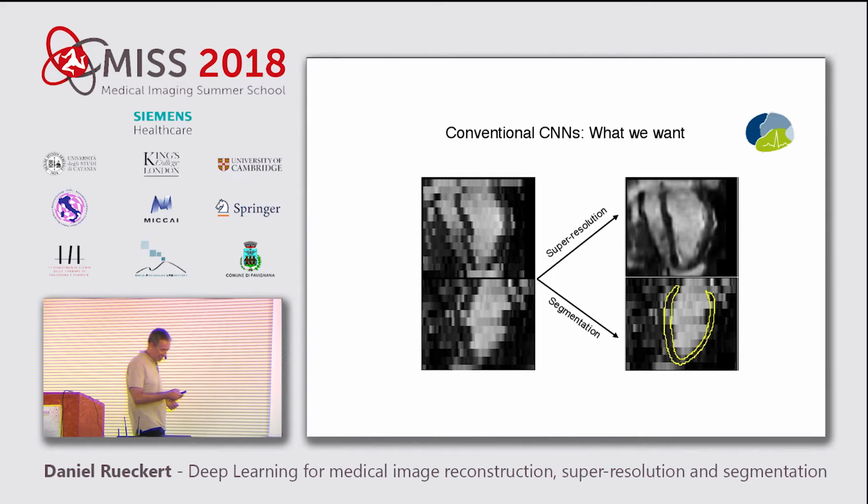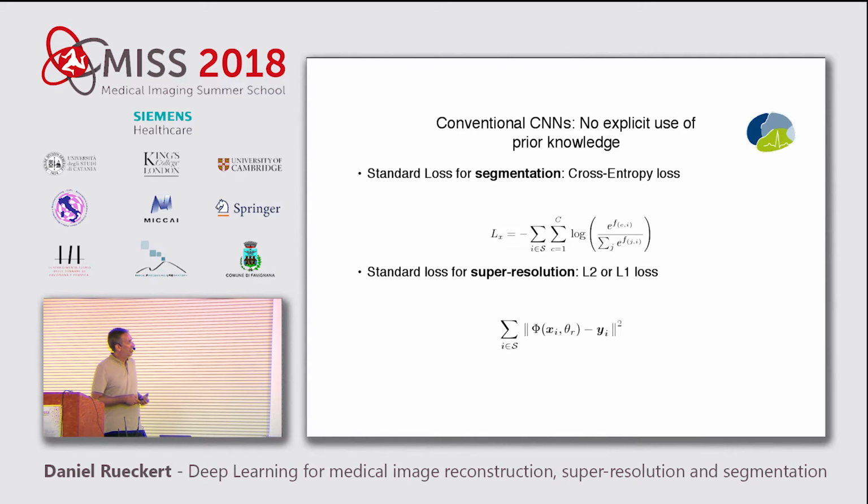So that's a challenge. We thought about whether we can train a neural network to have a more anatomically informed prior to do something clever. And it turns out if you can do that, hopefully we can generate some useful data even with this inconsistent data. And one of the reasons why we identified we have this problem is that we have a cross-entropy loss, or our loss function, which we typically use. Let's say we do segmentation, we typically use cross-entropy loss.